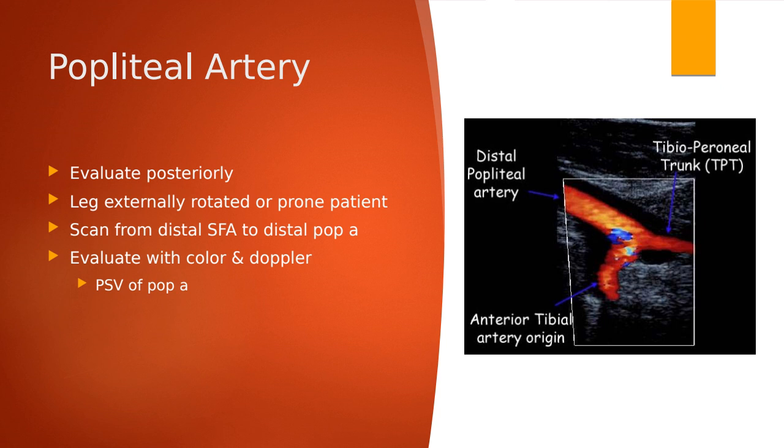We're now in the popliteal region at the back of the patient's leg. Same thing, we're still evaluating that just like how we do with a vein. We're going behind that patient's knee with the kind of acronym of the venous imaging where you have pop on top. That's how you can kind of tell when you are doing the popliteal artery versus vein.